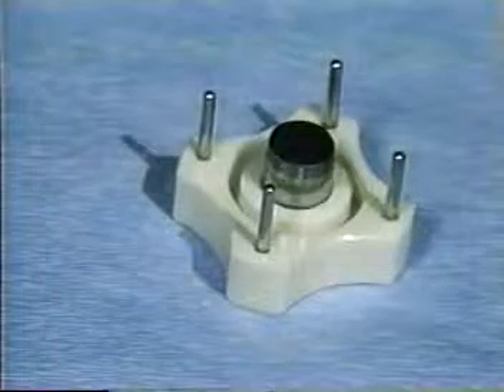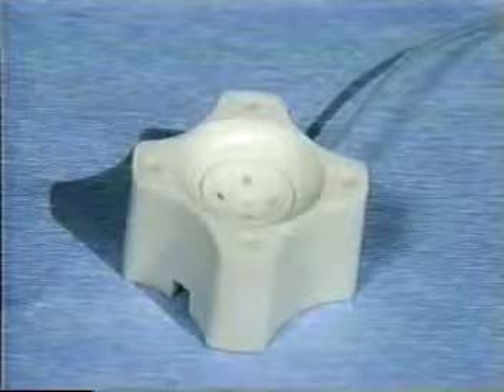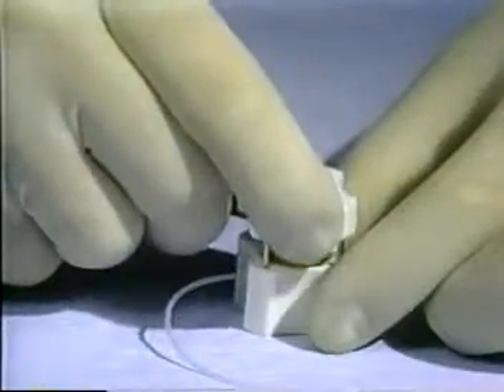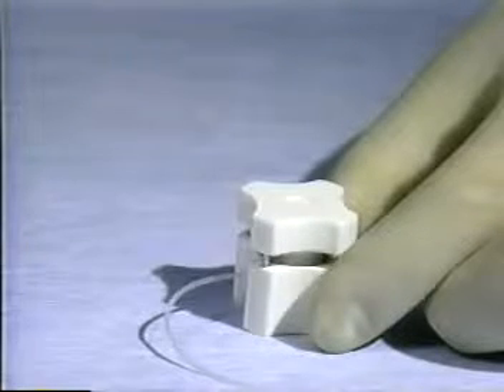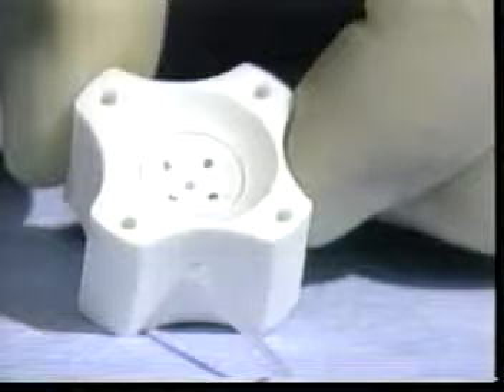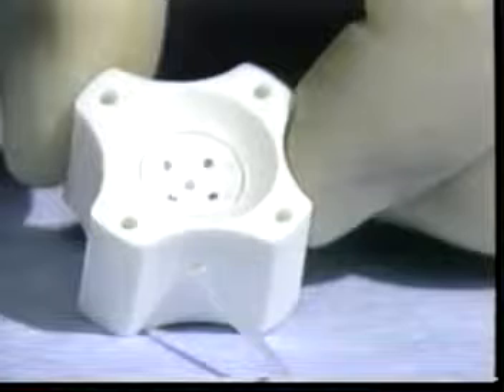One of the two instruments which make up the Barron system is the vacuum donor cornea punch. It consists of a blade assembly, a seating ring, and a cutting block with a small silicone tube attached to a syringe with a spring-loaded plunger. The cutting block has four holes where the steel guideposts of the blade assembly fit to make sure the blade is perpendicular and centered.